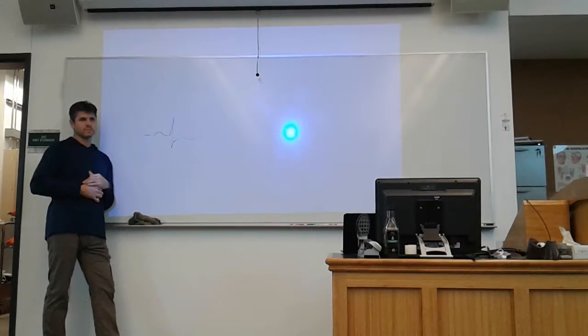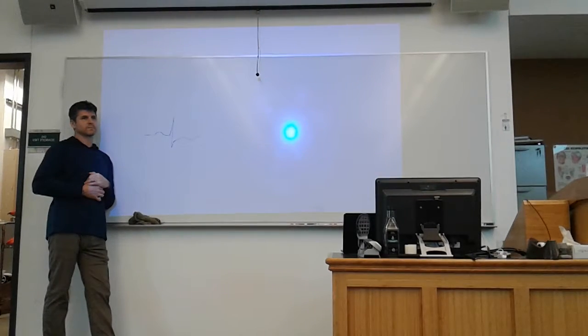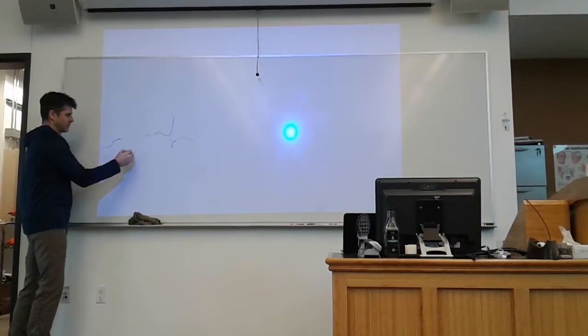And so with the flipped T wave, I'm thinking of it as like the direction of the electrical activity is taking a different route. That's correct. Okay, and that's just because we don't have a whole bunch of ATP, so more electrical activity is happening elsewhere? Yeah, so what's the normal depolarization process?